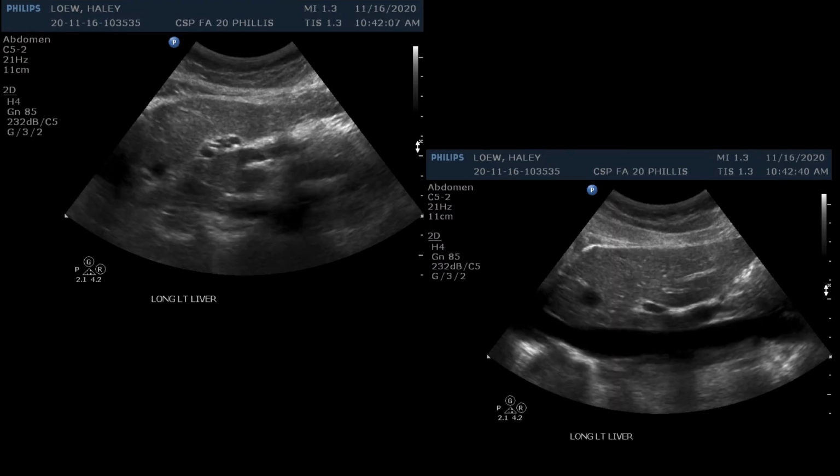The liver at the level of the caudate lobe and IVC are imaged next. It was difficult to find the patient's ligamentum venosum, as you can see, but that should be a landmark for your caudate lobe picture. Again, make sure your focus is the liver since that is the main organ we are showcasing in these images. My focus could have been lower for my caudate lobe picture as well.